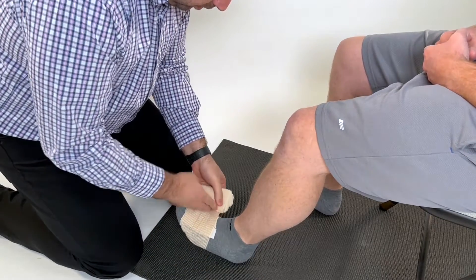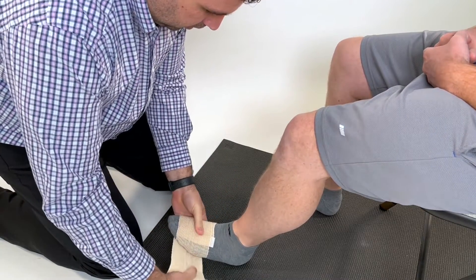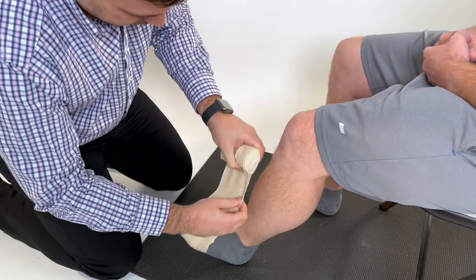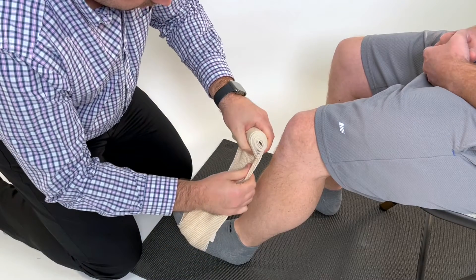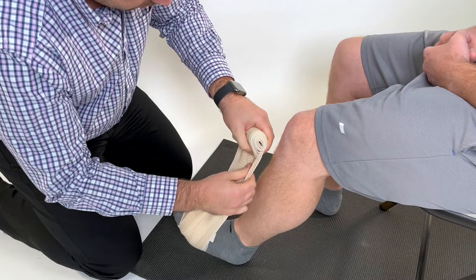Once you've created your anchor by wrapping around the foot 2-3 times, next you will want to come up and apply approximately a 50% stretch, depending on how much assistance your patient will need.